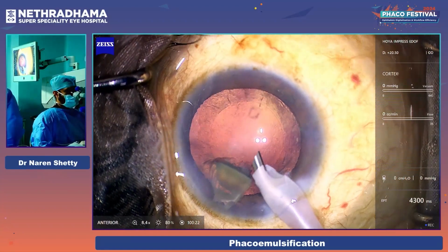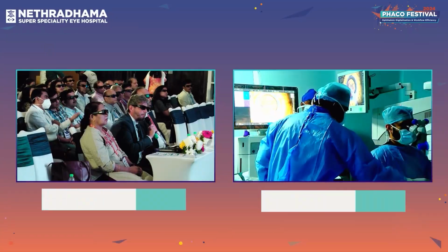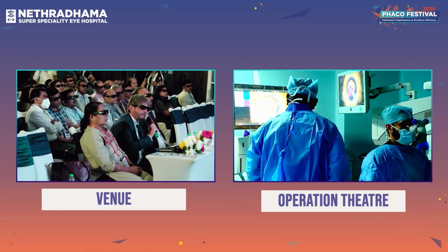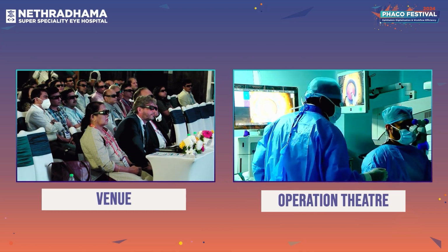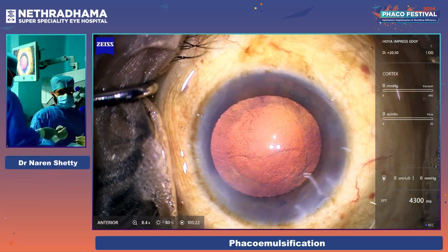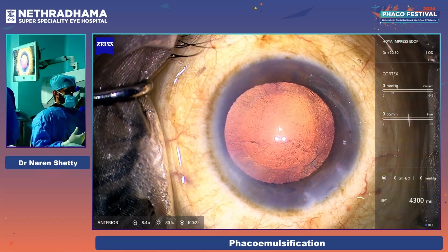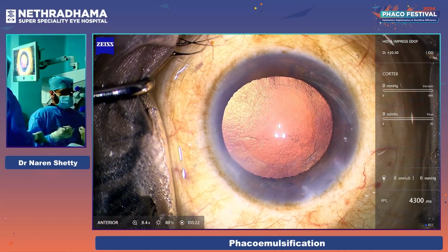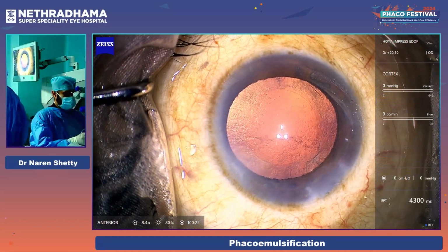You don't use any second hand in this part? Sorry? The second handpiece? Yes. Yeah, so I don't use it here. Why I don't use it here is, you see, from the side port, there's no leaks. So it creates much better fluidics. And then what happens is the pieces come to the phaco tip more easily and the chattering is lesser.